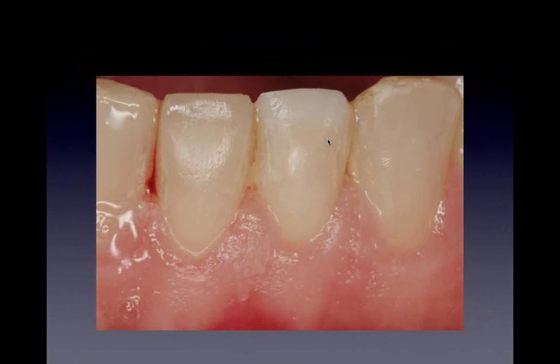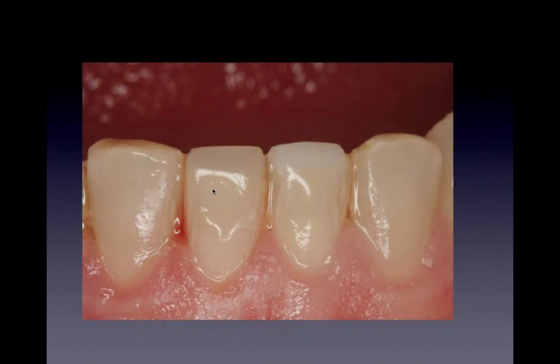So that's pretty much straightforward. Interproximal with different burrs and different strippers and try to get it there. So you can see the delineation here, very, very slightly you can see the delineation, but it blends a lot easier than just putting it on the edge. And that's the final polish. That's a pretty easy lower incisor. But again, wrapping it around is the bigger technique that has survived my composites for the long term.